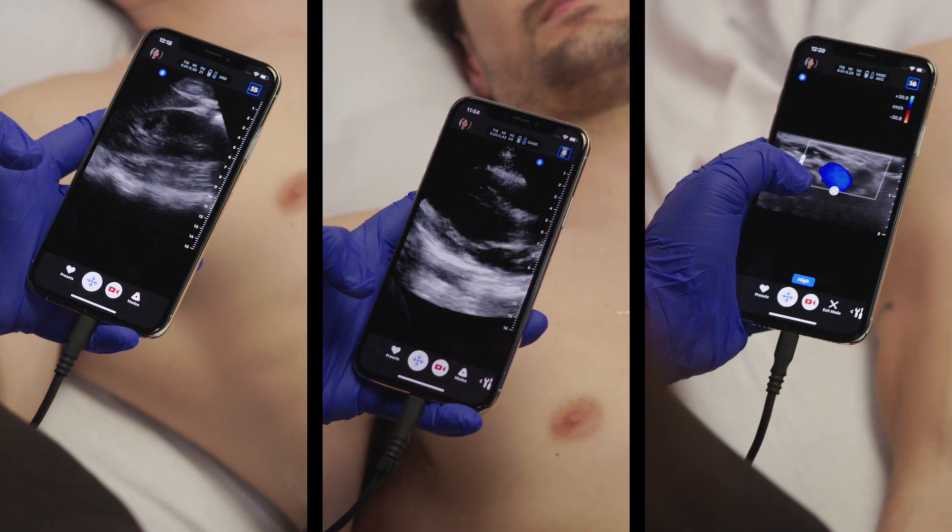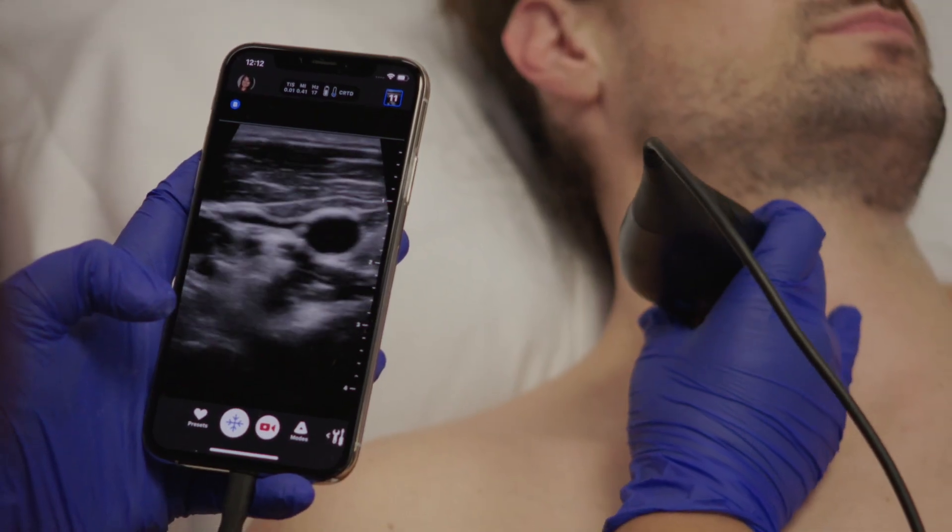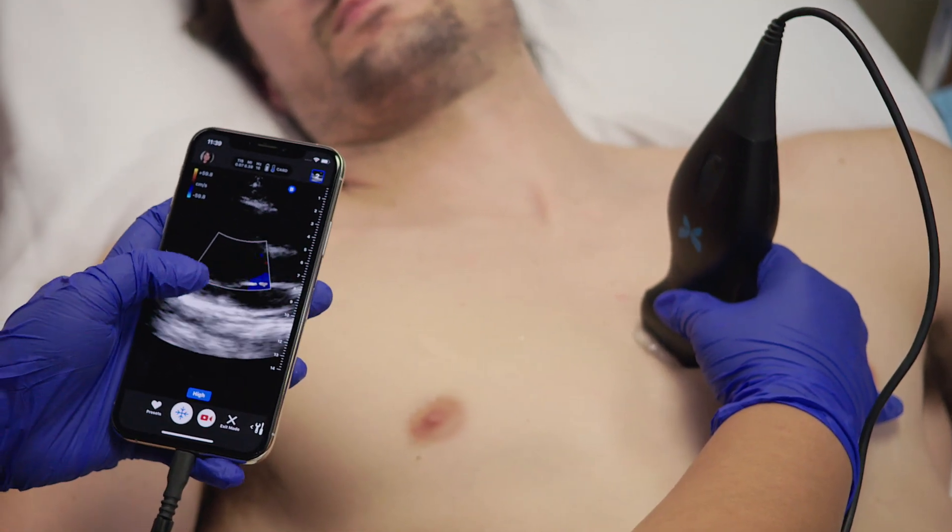The IQ can generate a curved, phased, or linear beam all on one probe because of our ultrasound-on-chip technology. That's right — no more changing probes.